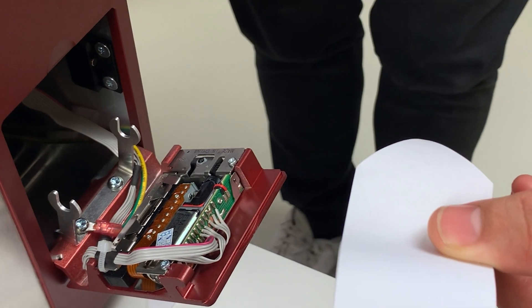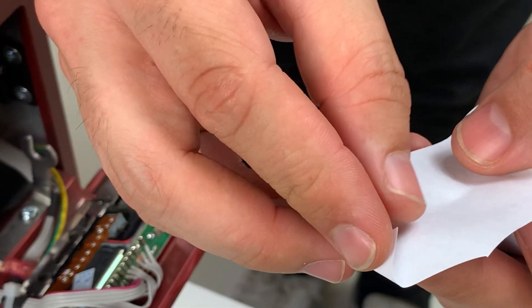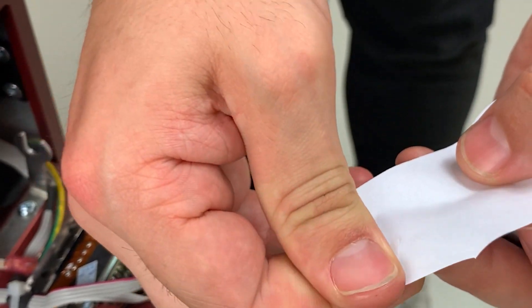Fold the paper as described in the manual and then thread it as shown. Follow the description in the manual during the exchange.